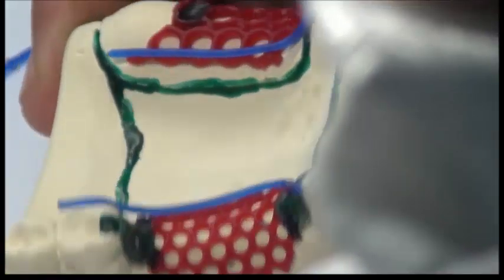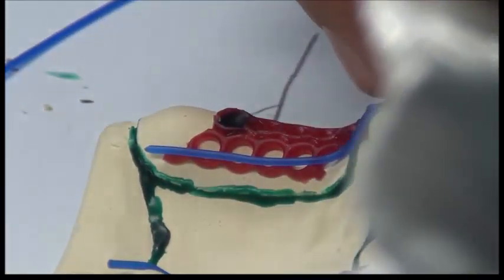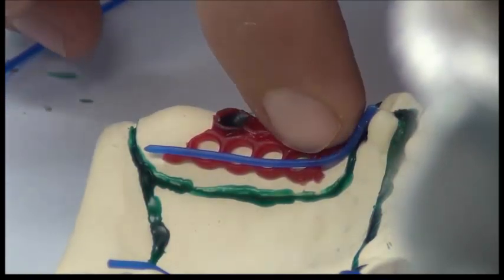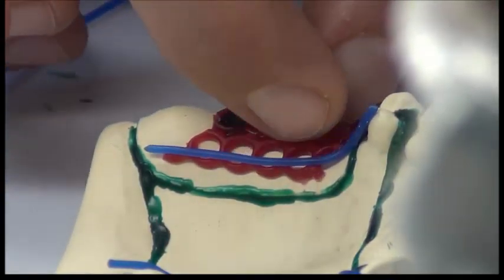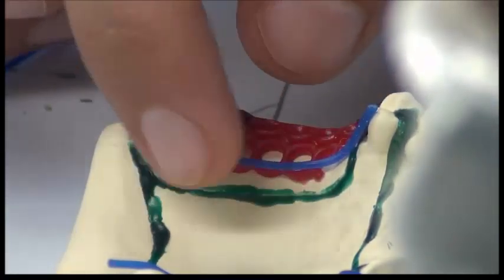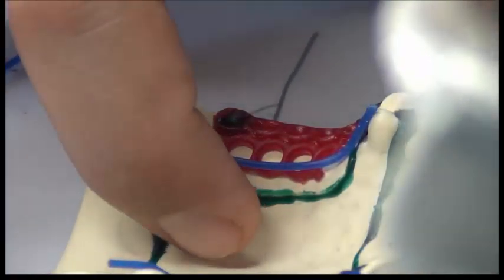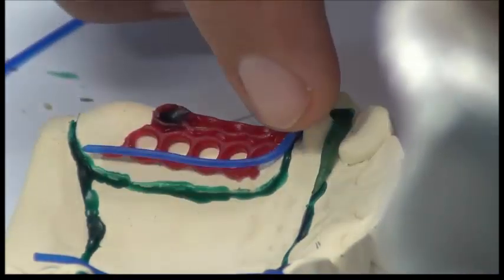Okay, just for the clarity of the voice, I'm going to repeat it. So it's running down vertically from the palatal surface of the guide plate with an angle clearing the place for the new tooth to be added. So I have enough bulk for the new tooth to be added. I'm going down palatally over the metal. I'm still over the metal added. I'm not away from it, but I am more occlusal than the internal finish line. So this is my wax added.